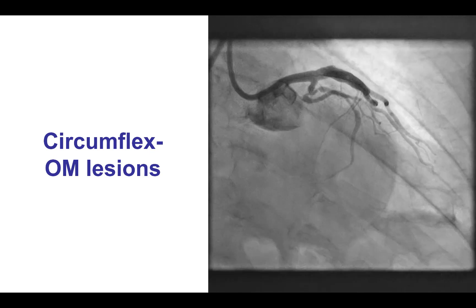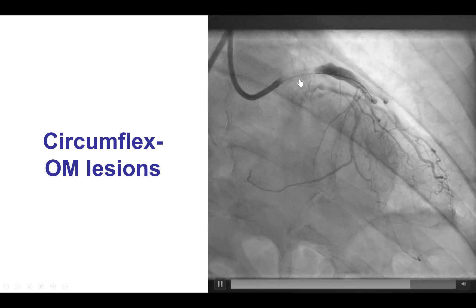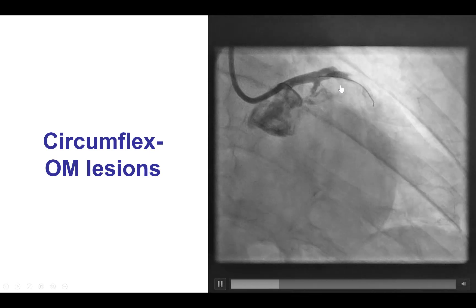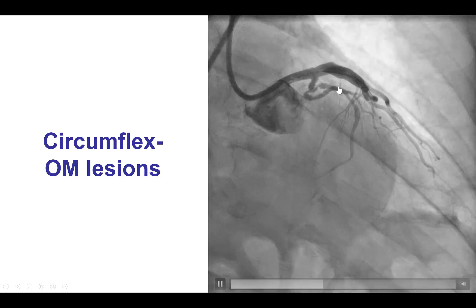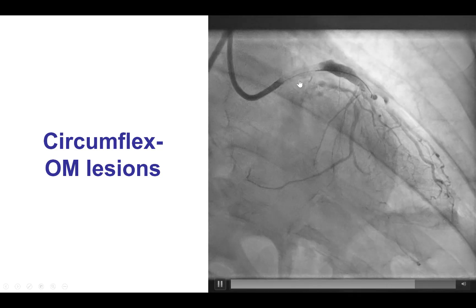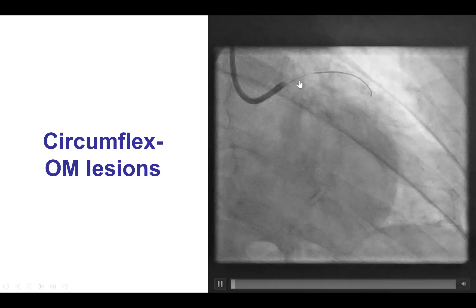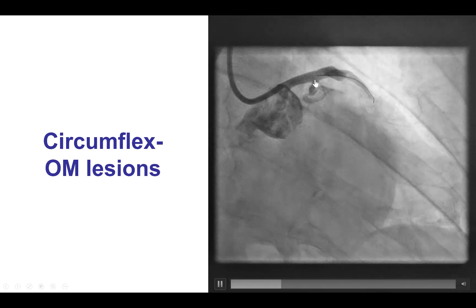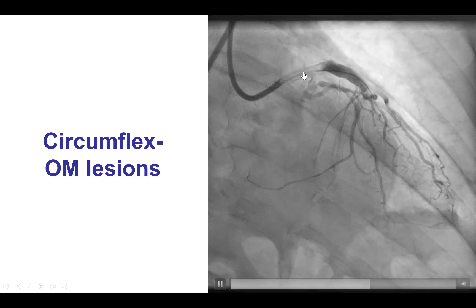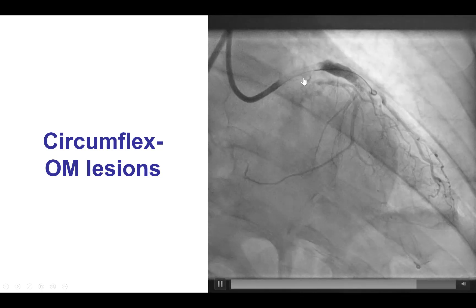This is the target lesion. It is a lesion in the circumflex and the obtuse marginal branch. In this view, it appears that this is a Medina 0 — no significant disease in the proximal main vessel.